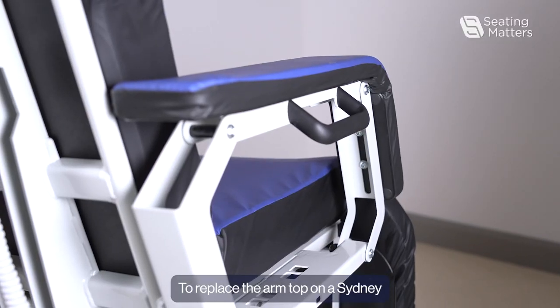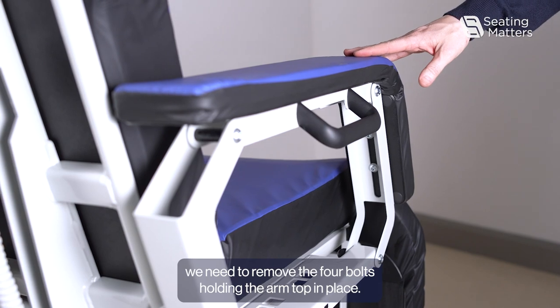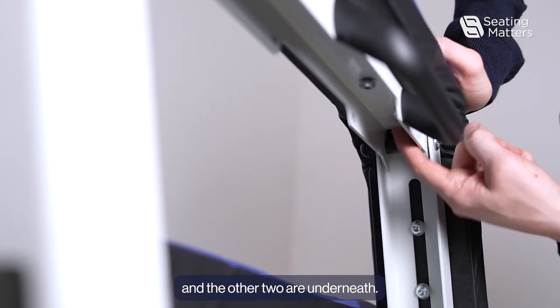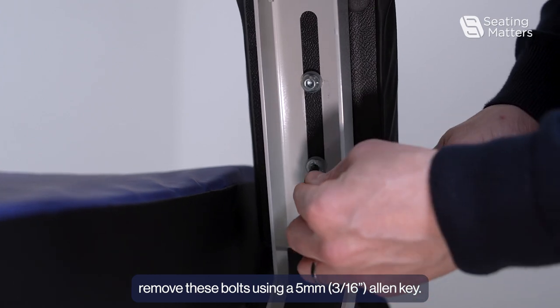To replace the arm top on a Sydney, we need to remove the four bolts holding the arm top in place. There are two bolts located here on the arm top and the other two are underneath. We remove these bolts using a 5mm Allen key.